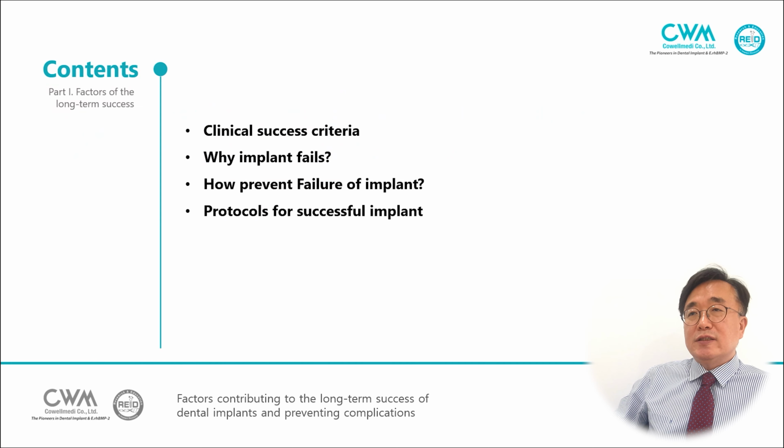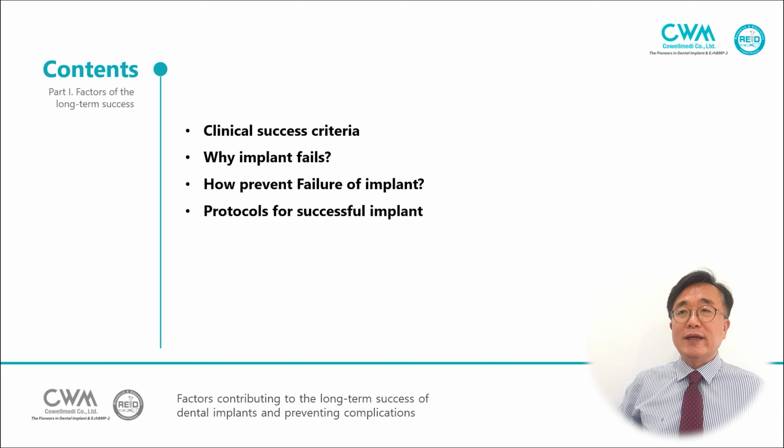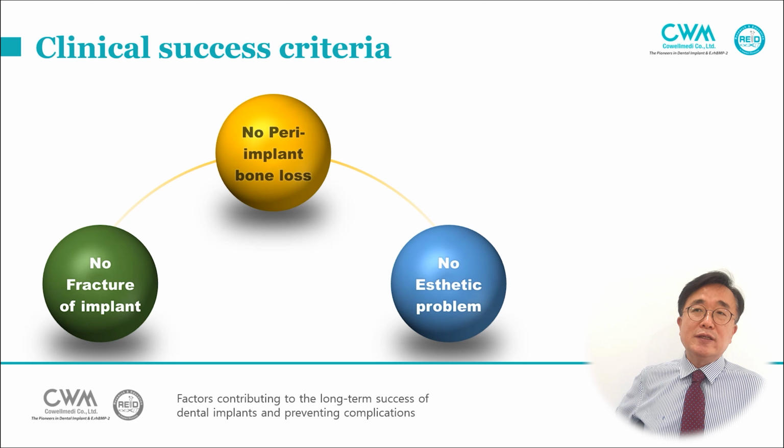The content is composed of clinical success criteria, why implants fail, how to prevent failure of implants, and protocol for successful implants. First, clinical success criteria is composed of three factors. First, no peri-implant bone loss; second, no fracture of implant; and third, no aesthetic problem.